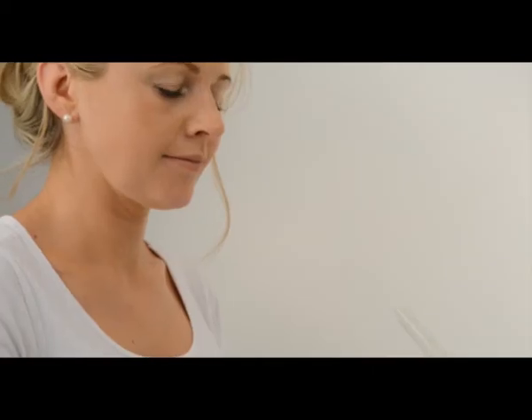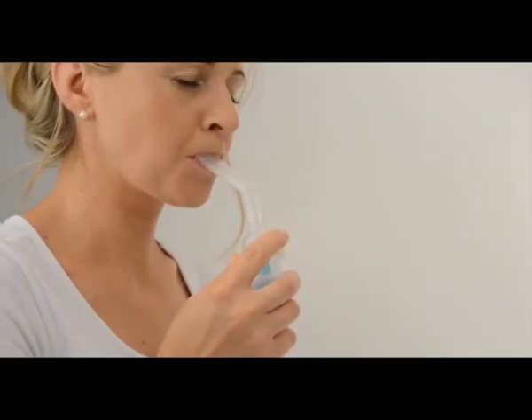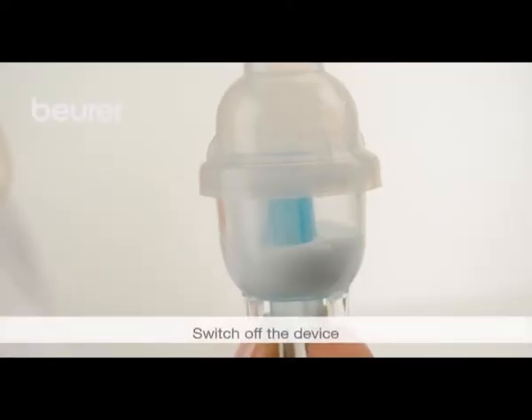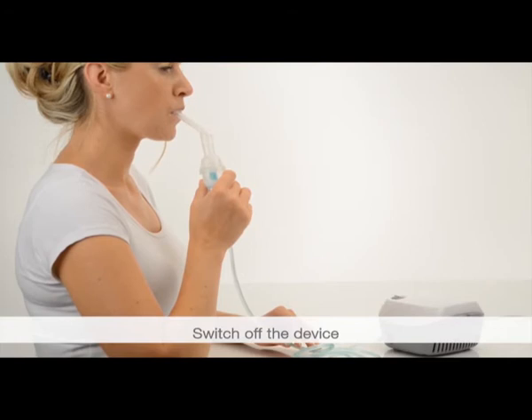Place your lips around the mouthpiece. Breathe in the atomized medication deeply. Once the medication has been atomized, switch off the device.